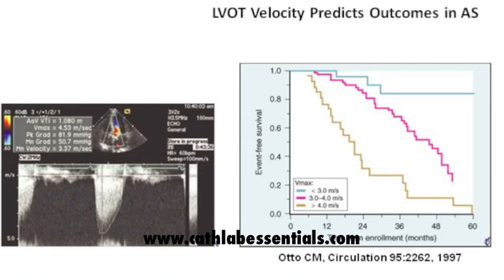We use echocardiography as the hemodynamic non-invasive standard. On the upper left is an echocardiogram showing the four-chamber view, not the best seen to identify aortic stenosis, but commonly used to assess associated findings of LV size, wall thickness, LV outflow tract dimensions, and other chamber function. On the lower left is the Doppler outflow tract velocity signal, and we know that 4v squared is commonly used as our gradient translation from the velocity measurement.